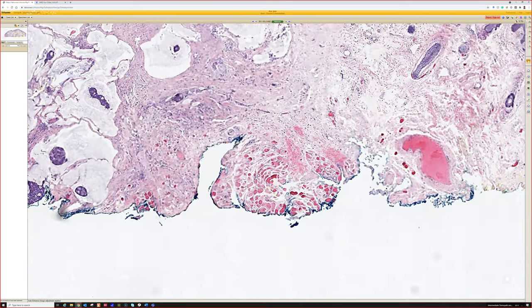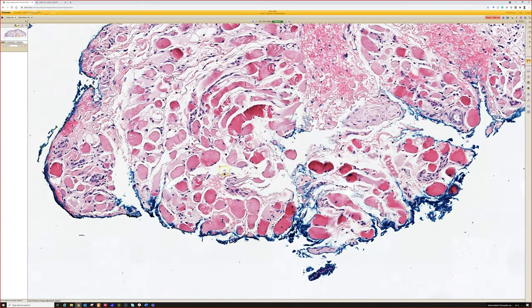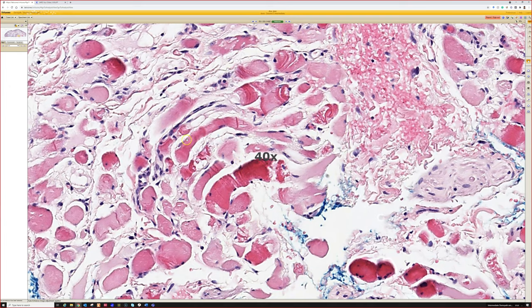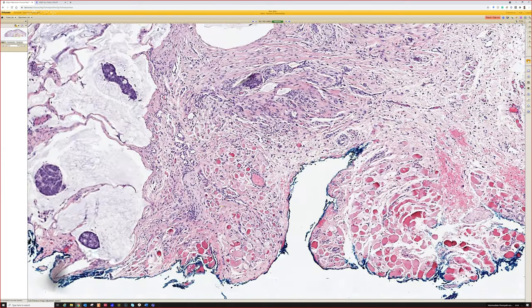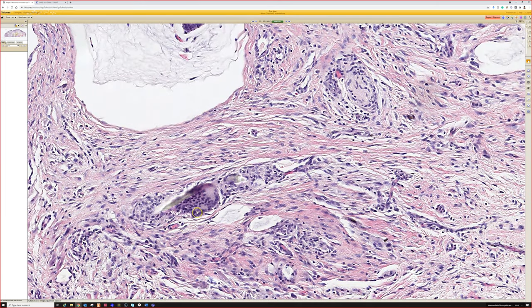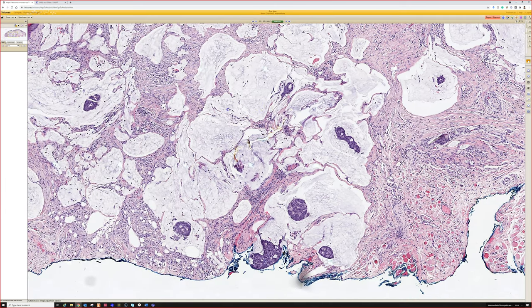And you can tell right now, look where we are. We've got skeletal muscle bundles down here with their peripheral nuclei, or if you see them cut in longitudinal section, maybe not on this scan, but you can appreciate the striations. So we're in the eyelid probably, right, where we've got a lot of skeletal muscle close to the face. There's a little hair shaft with a giant cell around it from a ruptured hair follicle. And here, which is just incidental, I don't know why I told you that, but I saw it and I thought it was interesting.